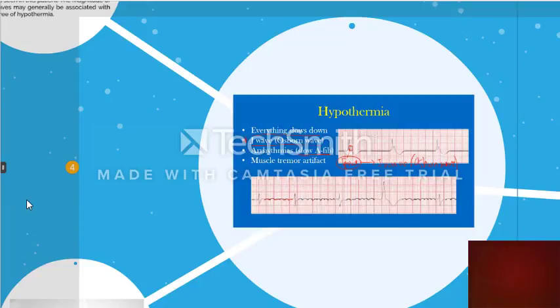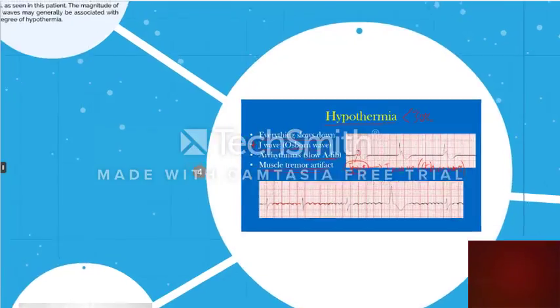A similar artifact can be seen in patients with Parkinson's disease because they have a resting tremor. Now make sure not to confuse these artifacts with a flutter. You may think of these as a flutter, and it is really not. So if the person is hypothermic, with a temperature below about 30 degrees Celsius, and you see this wave, it is not likely a flutter, but more likely a muscle tremor artifact. See if the patient is shaking a little.